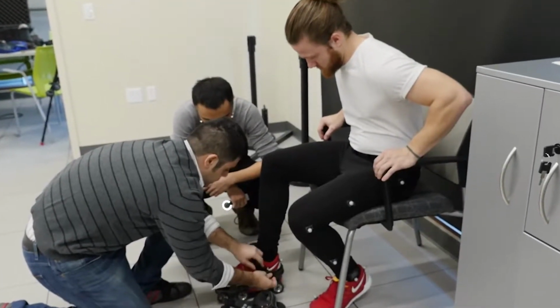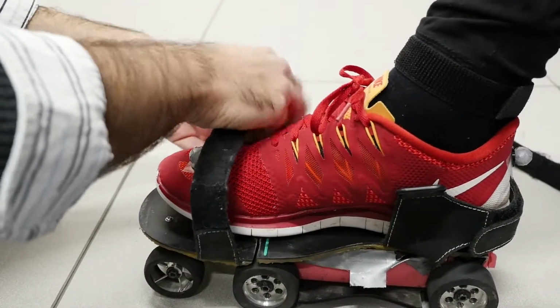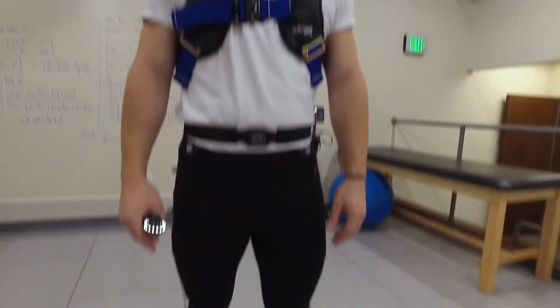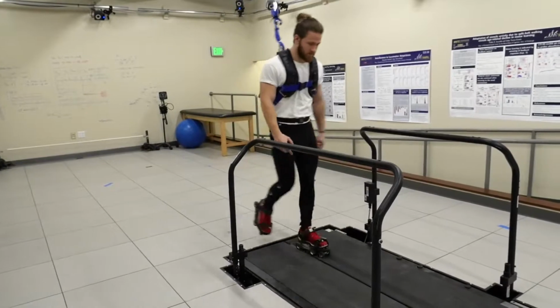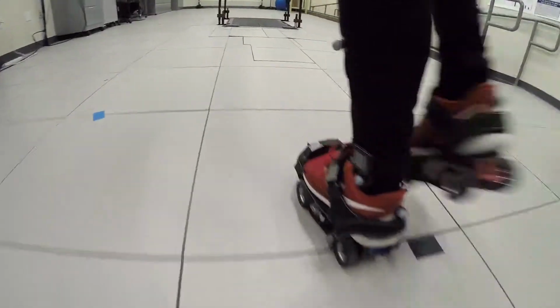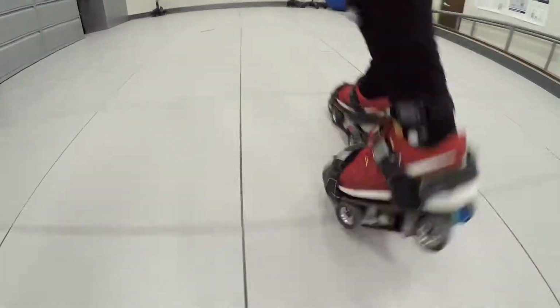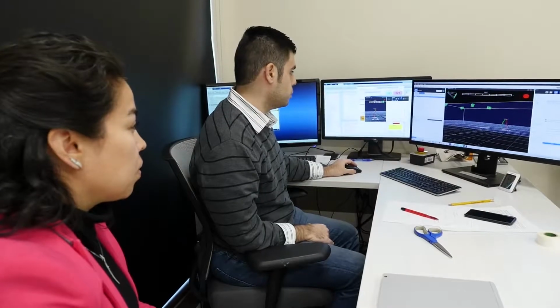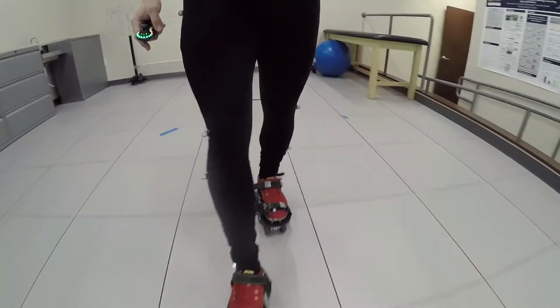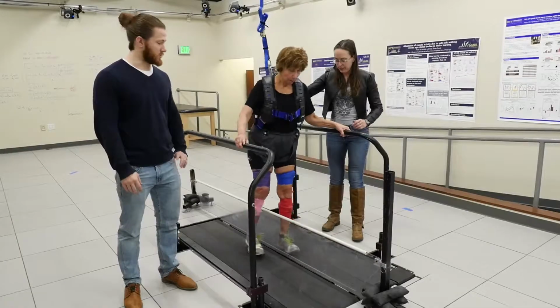These motorized shoes work on the same principle as a treadmill. They can be programmed to control the speed and length of the steps. These are an early prototype that they're testing with young, healthy people. Eventually, the stability and control algorithms will improve to the point a person with an impaired gait could safely put them on. We can train them first in the lab under a very safe and constrained environment so that they would get used to using this pair of shoes. And then eventually the idea is for them to wear them, like take them with them home and wear them everywhere they walk. Yep, there you go.